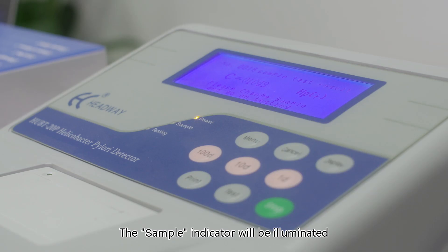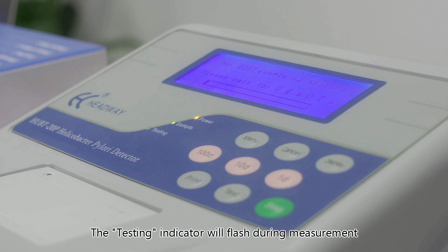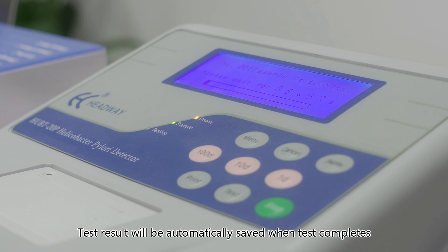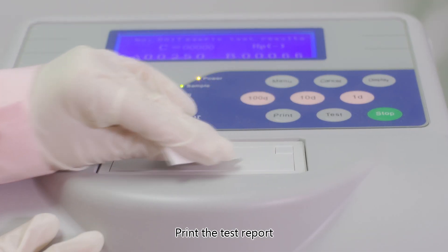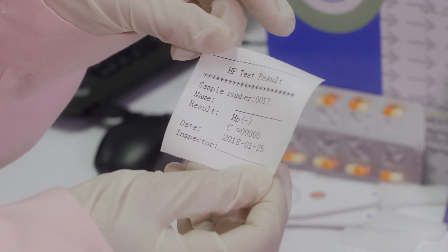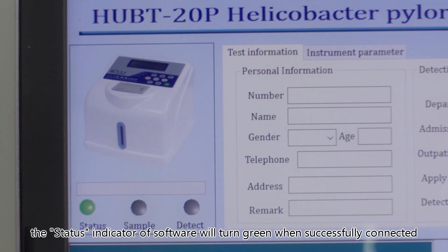Sample testing: insert the sample card into the measuring slot. The sample indicator will be illuminated and measurements will start automatically. The testing indicator will flash during measurements. Test results will be automatically saved when the test completes.